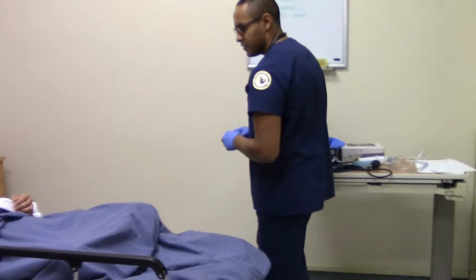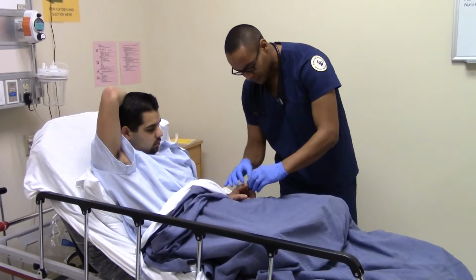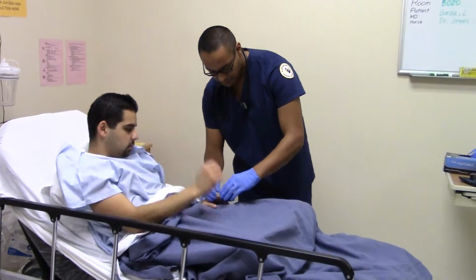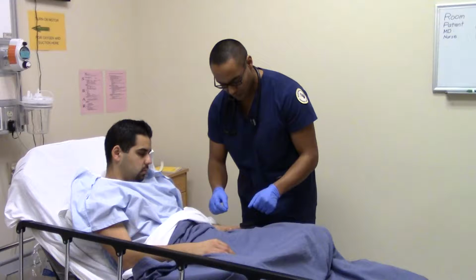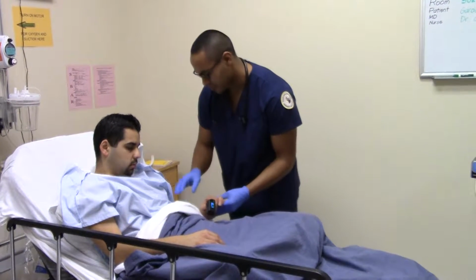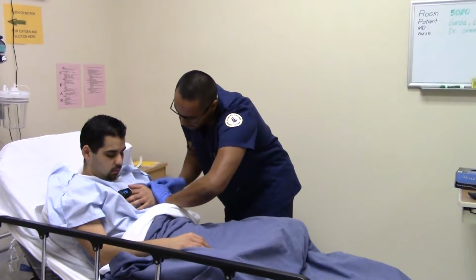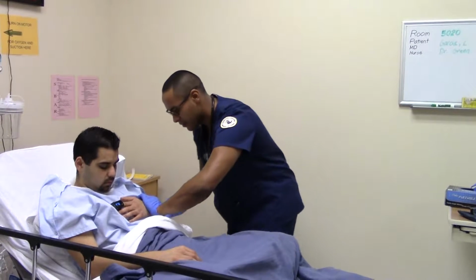Alright, I'm going to check your oxygen. I'm going to put your hand right here, okay? This right here. There we go.